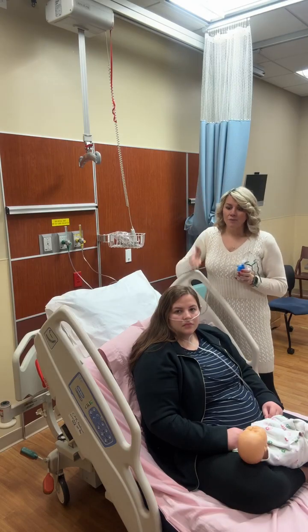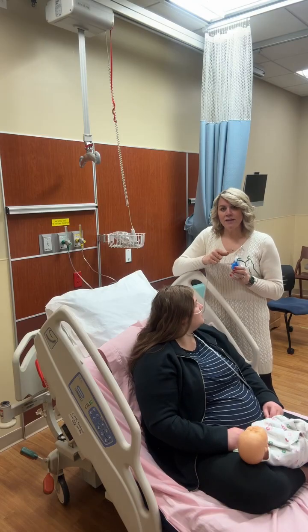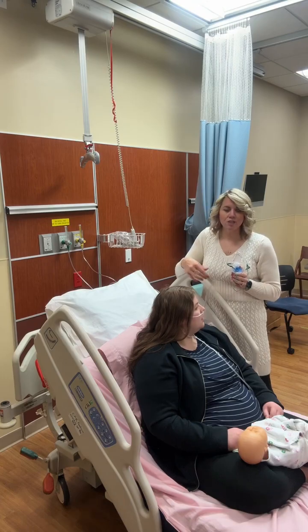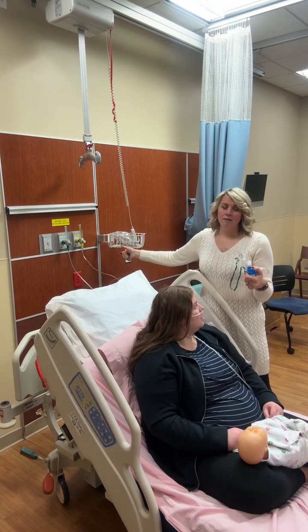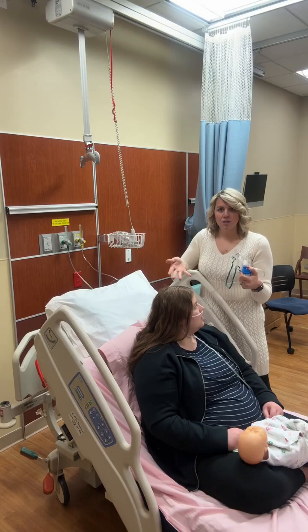and then before I even turn this on, I'm going to have a conversation with her because I'm getting ready to put something over her face. And depending on the situation, if she is an asthmatic patient, she has anxiety, she's scared, she's short of breath, we never want to put a mask on a patient and then turn on the flow meter. You want them to feel comfortable with what you're doing. So you want to give them a full explanation of what you're going to do to them before you actually do it. So I'm going to show you how to do that.